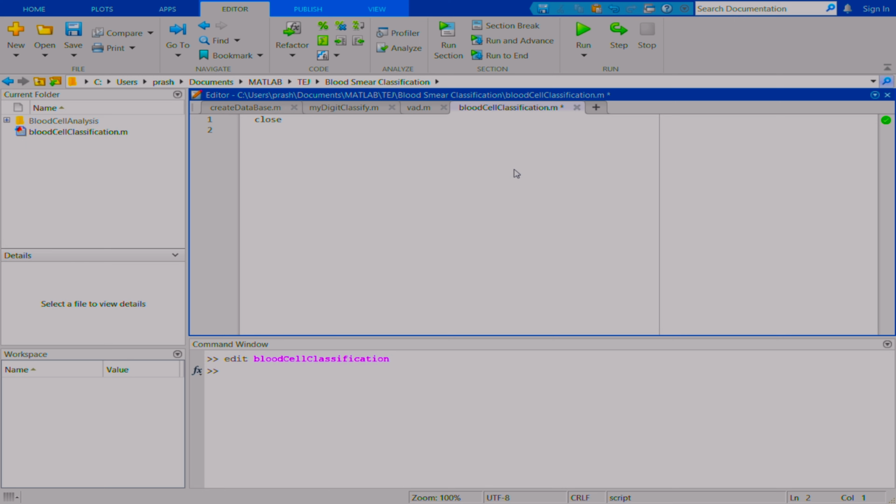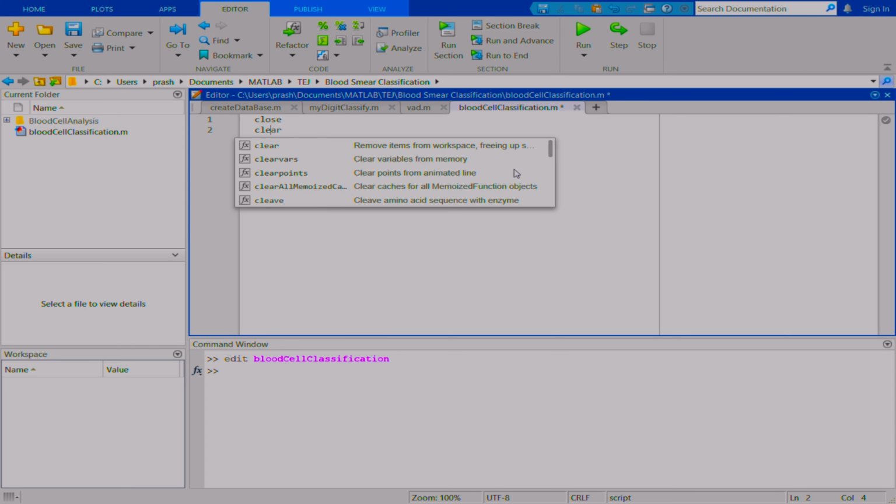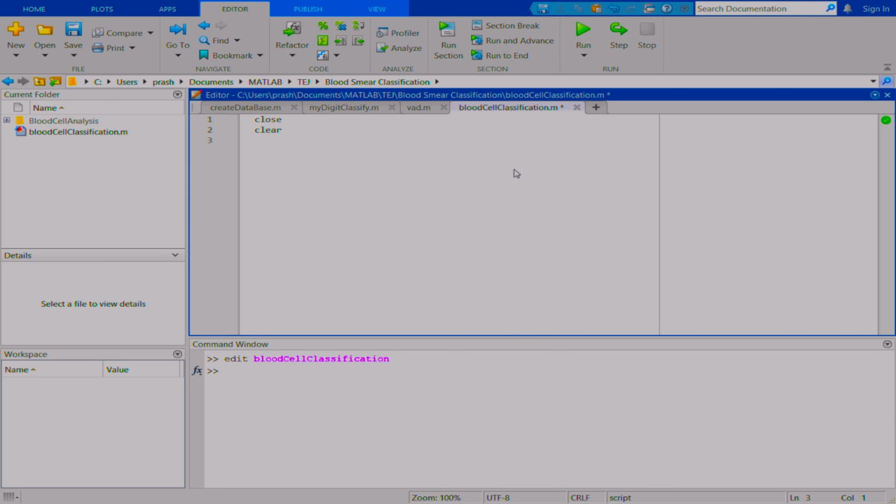Okay, then clear, clc. Okay, so let's run the section so that everything is clear, and I'll go for a section break. So in the next section, I need to read the data.